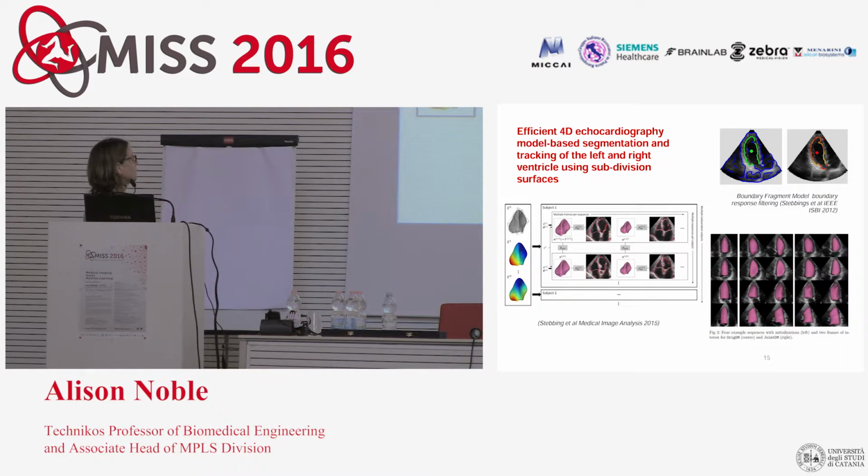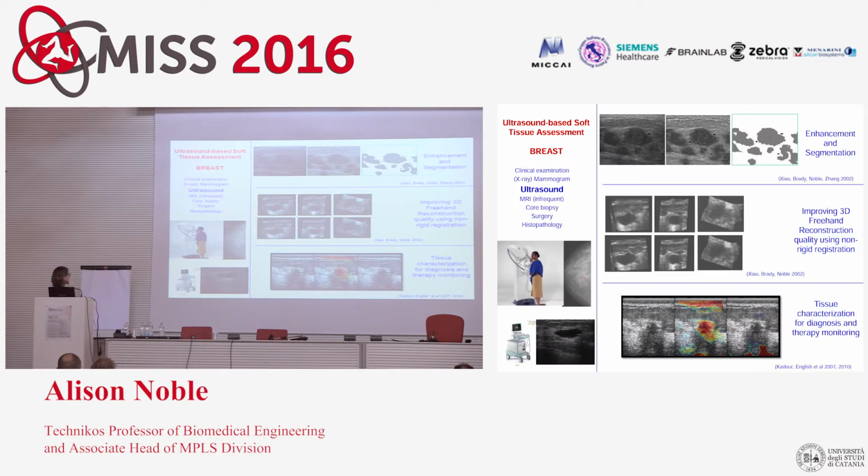Another example of working with 3D ultrasound is that it has allowed us in the field to go to 4D, that's 3D plus the time dimension, and do 4D analysis. In our case, we have used some machine learning methods to help identify the correct boundary responses, and then used model-based fitting, both for looking at the left ventricle, which is shown here, and more recently the harder geometry associated with right ventricle analysis. So that's showing you cardiology.